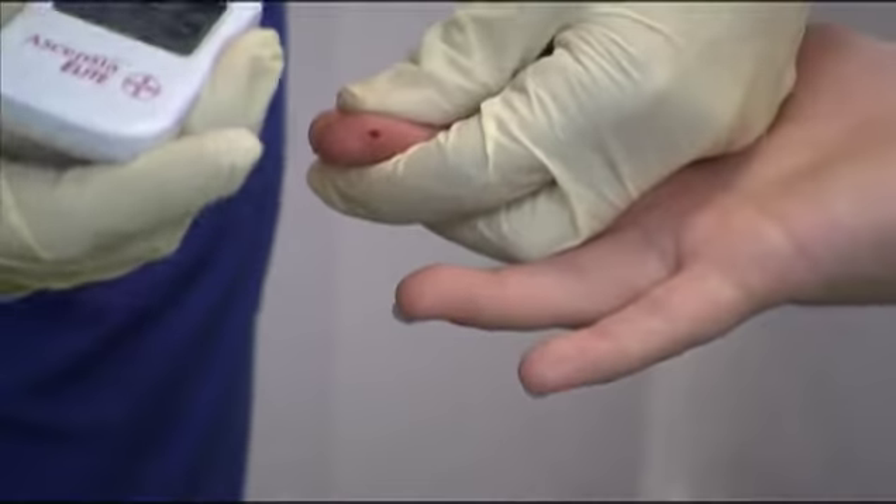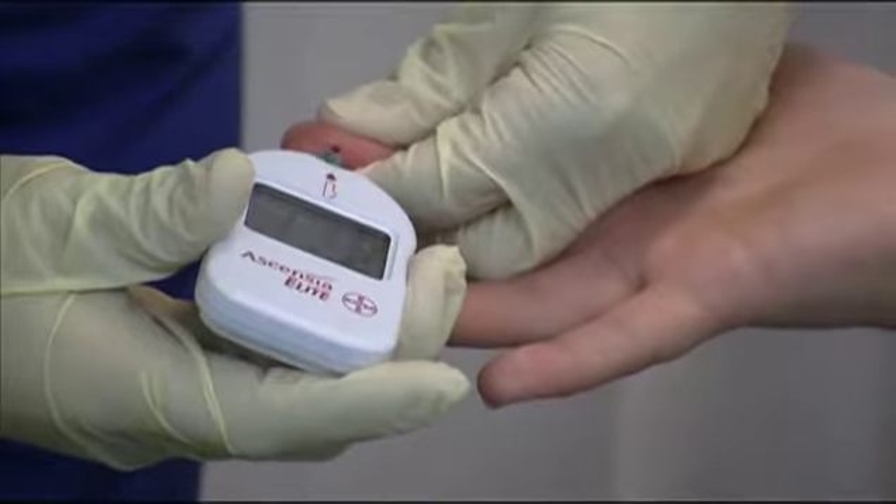Place an adequate amount of blood on the test area of the strip. Use the correct testing strip for the machine.